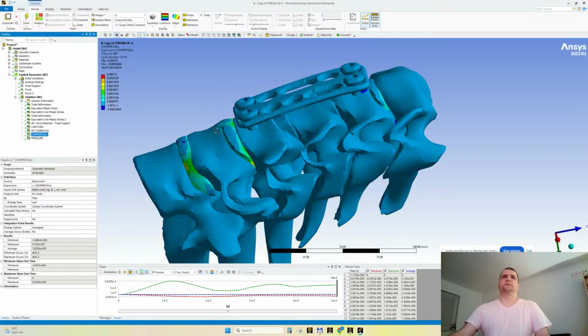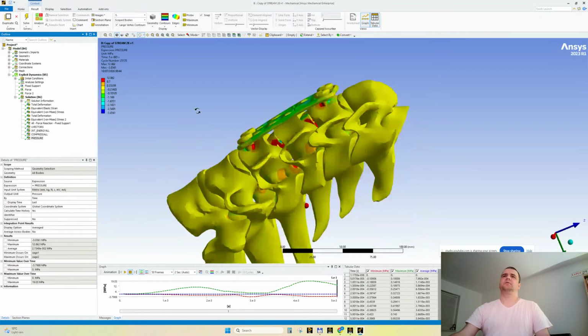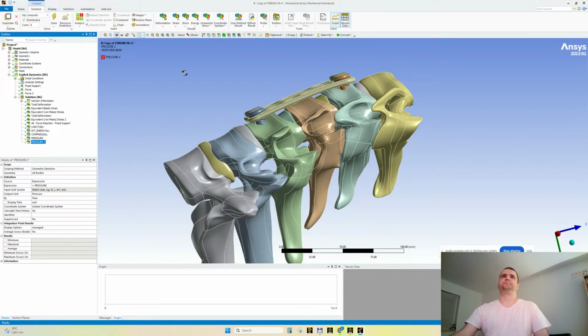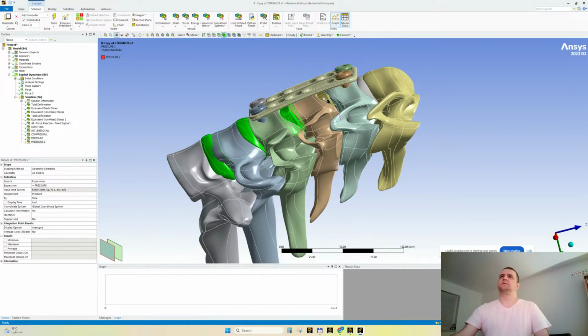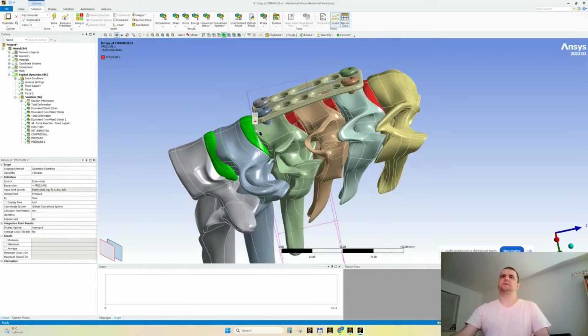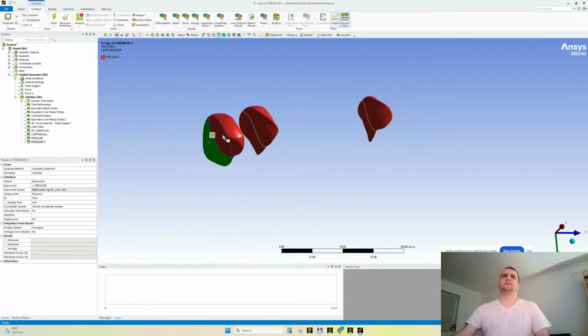Energy, and remember not to despair, we do have this COMPRESSALL, yes. And if you want to evaluate the pressure in contacts, you know what I would do? I would duplicate without results, and I would select, let's say, only these ones. This is one thing. And the second thing, for example, you want to see the pressure in the discs.